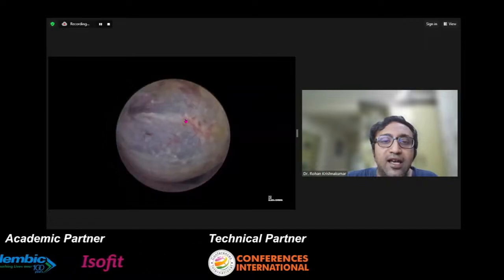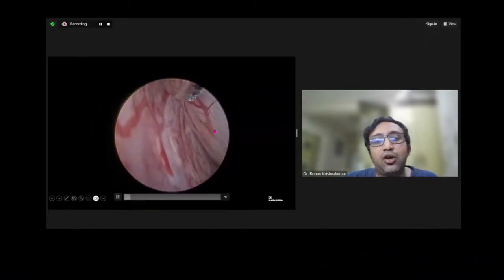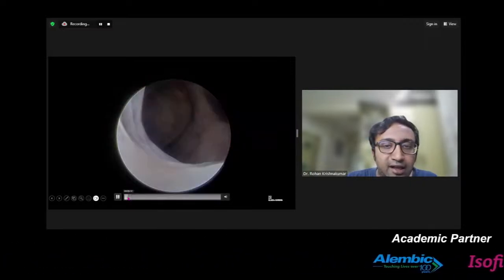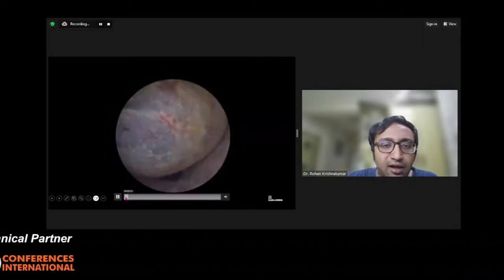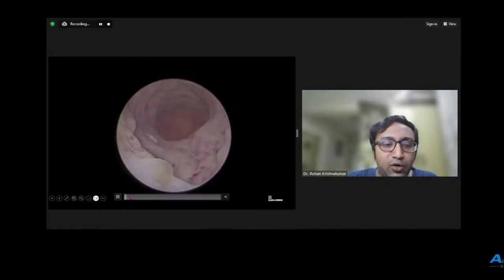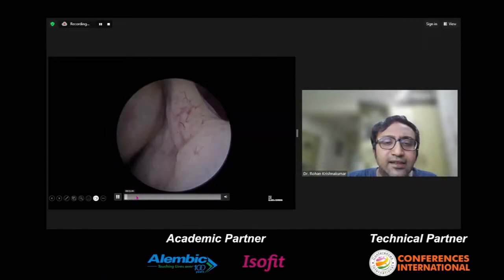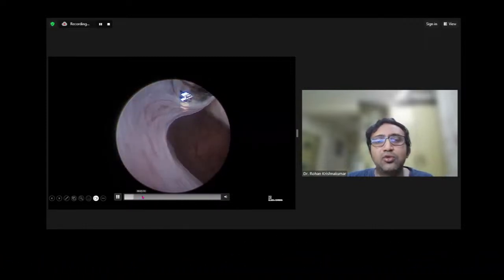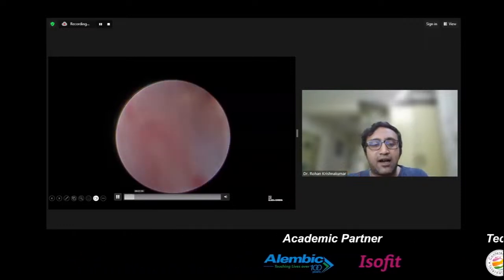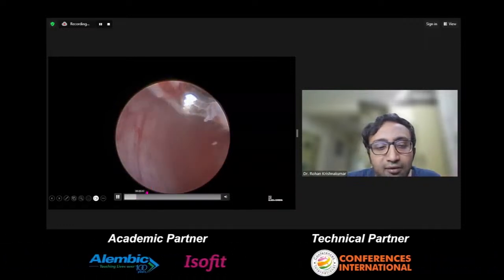So here you can see there is a missed abortion, the GSAC in the right horn. You could see a septum in the left horn. If you just missed it, I'll take it back. You can just see in the starting. Yeah, there is the left horn here, and then when we go towards the right, you can see a sac there. So these things are easily going to be missed out when you do directly a DNC because you're going to dilate. You don't know which cavity you're going to approach. You're going to damage the entire endometrium while doing your DNC.